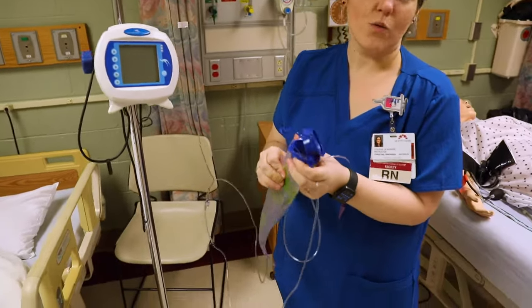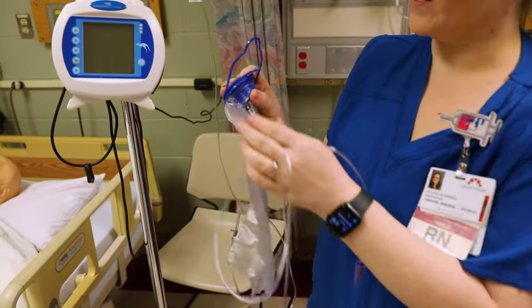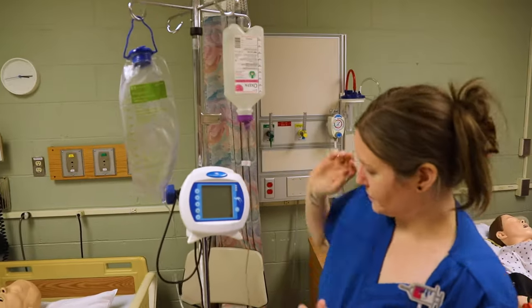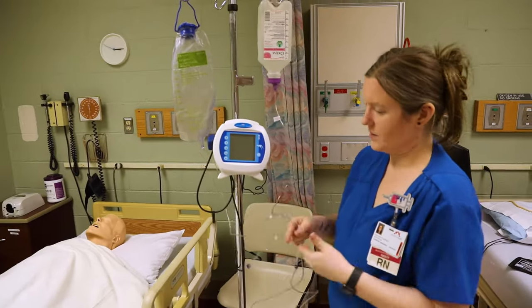Then you would open up your bag and fill it with sterile water. When you're in the hospital, sterile water is ideal — there are times when people at home use tap water, but sterile is preferred in the hospital. So we're going to say both of those are now full.